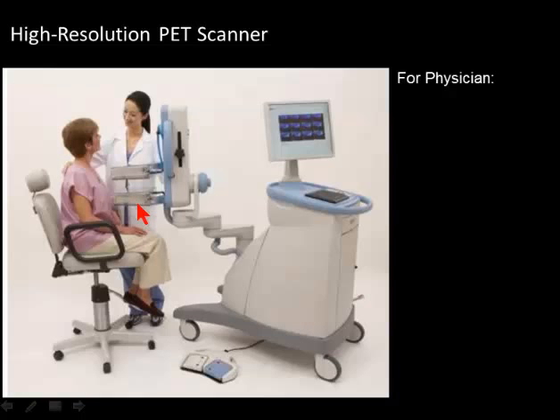Anatomic imaging is still important. We do want to see what it looks like on the mammogram. Now we want to ask the question, is it taking up glucose? Is it abnormal? But we want to be able to see the small stuff. So it has a 2 millimeter spatial resolution. It is 3D tomographic. Hologic spent a lot of money to develop tomosynthesis because they know that looking at a 3D object using a 3D approach adds additional value. This is limited angle tomography.